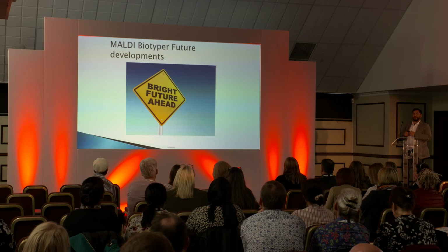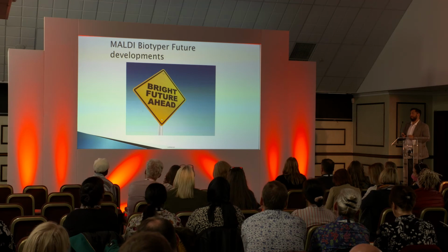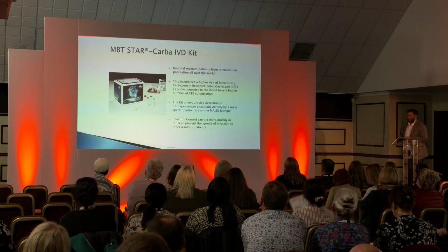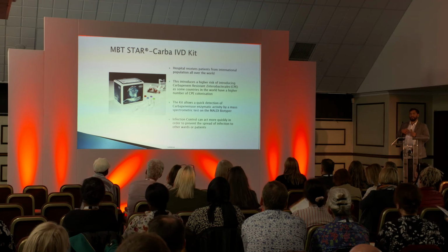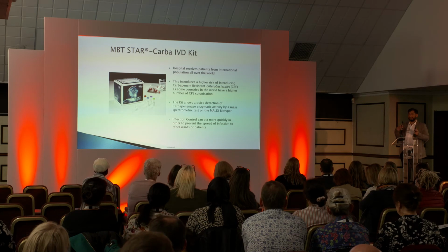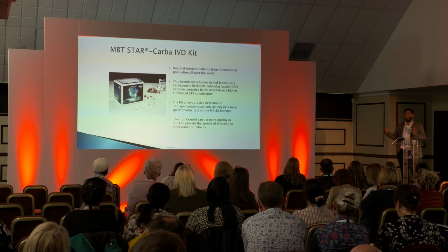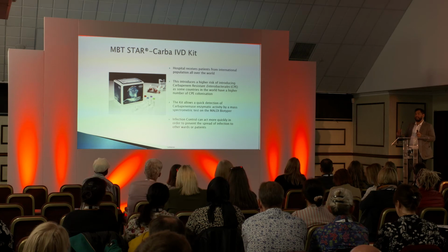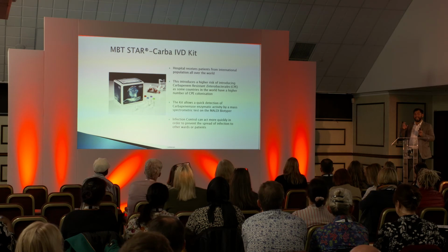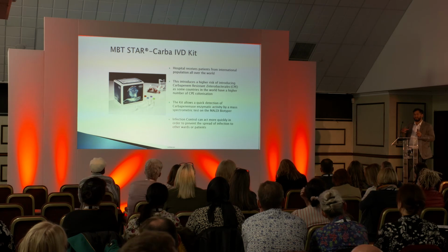So I've talked about enough developments with Maldi-TOF in our laboratory that we've done already, but we're still planning more, and I think there'll be more ahead for us. So I've talked about resistant organisms. We're an international hospital. We get patients from all over the world that are referred for specialist treatment. And what comes with that is that each country is quite different in terms of their prescribing, so there are some countries which are more prevalent for having resistant organisms. That is quite scary, in the sense that bacteria are very clever and they can transmit different genes to other organisms so that they acquire those resistance mechanisms.